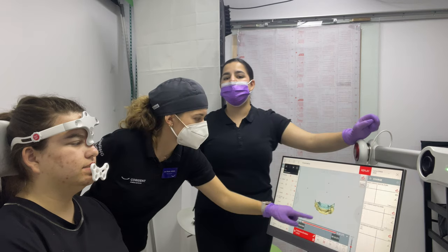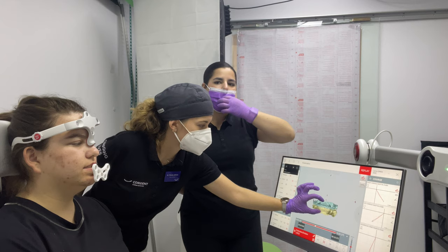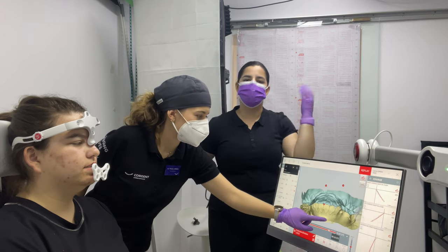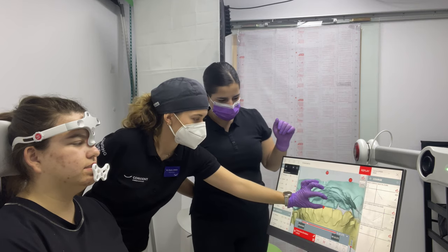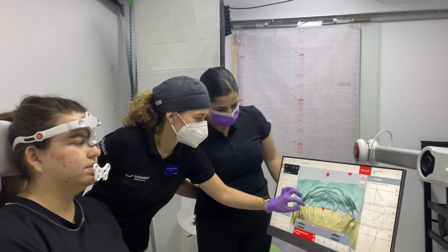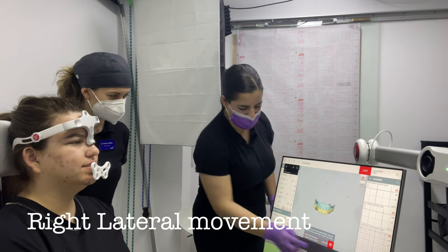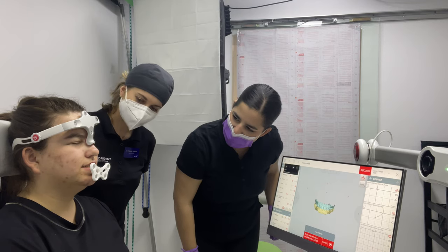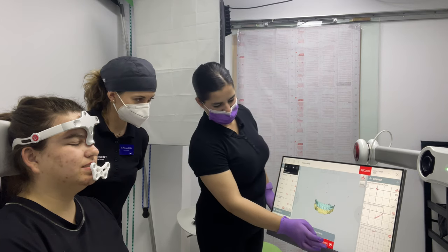1, 2. It's nice that you can see from different angles that we cannot in real life. So we can see the protrusion movement from the throat or things like this. Yes, you can actually see from behind. Okay, do tap, tap, tap. Okay, stay close, and now do the right movement there. Okay, one more time. And one more time. Yes. Tap, tap.